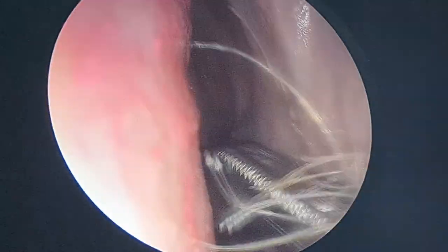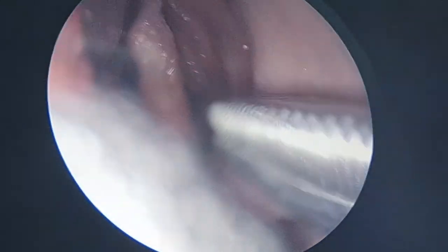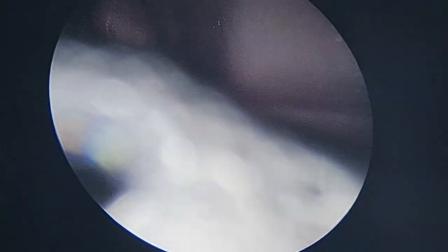But before I start the instrumentation, a word of caution for everybody. When you do instrumentation, always navigate your instrument with your telescope. See this.